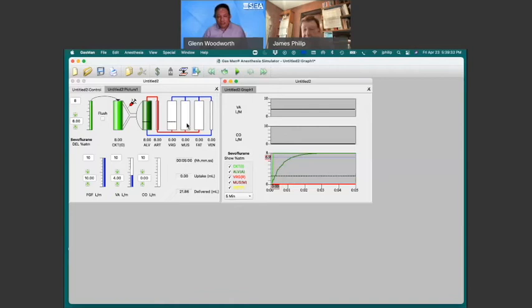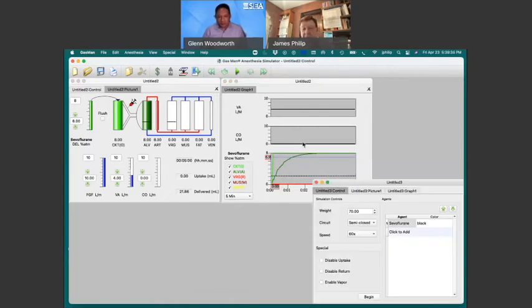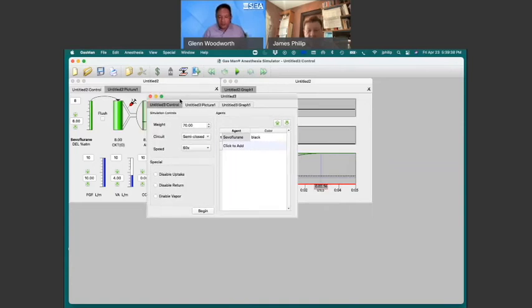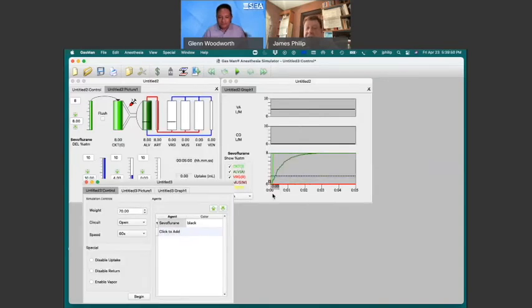Okay, so you might now run a simulation like this, and then the subsequent simulation might illustrate another point. And as you worked your way through, you'd eventually become an expert in inhalational anesthetic kinetics. Exactly. And in fact, we'll superimpose the graphs of each of these on the initial one, and that superposition will then draw all of the same graphs that Seymour Kety had in that original article.